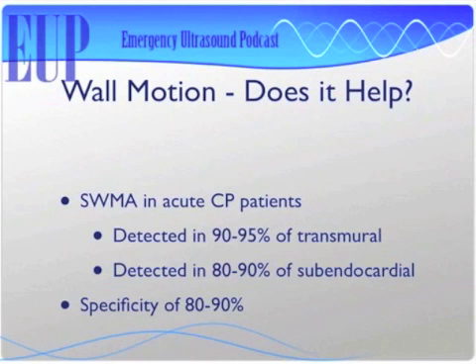That's pretty awesome. However, I know I can't get an echo in most of the emergency departments that I work at, so I think you were suggesting that maybe I actually do the echo on these patients. Is that what you were suggesting? I might suggest that. Well, is there any actual literature to support that I can actually do it? Obviously, in the echo lab, they can do an echo. Right. No, so funny you asked, Matt.